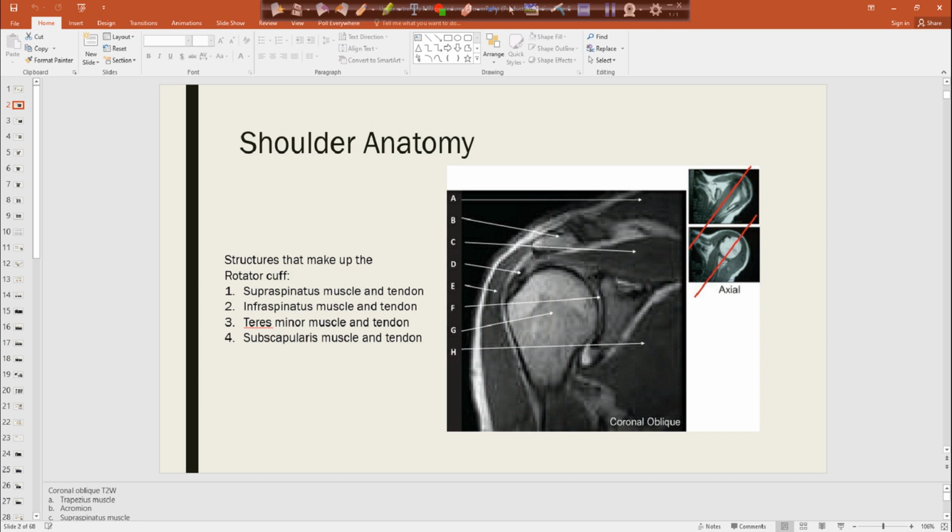So this is a T2 weighted image. The only fluid we can see here is in that synovial cavity. We have bright signal here. It's not the best image. This is just blown up. So T2 weighted, not fat-sat, because our subcutaneous tissue is still bright.